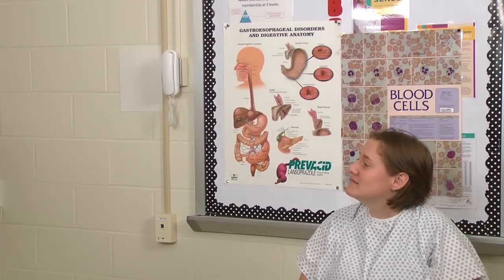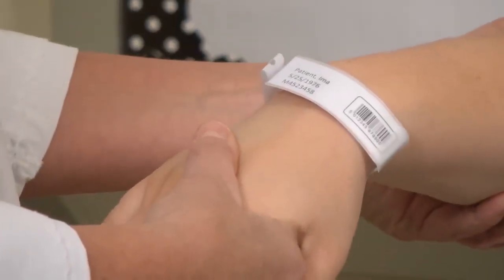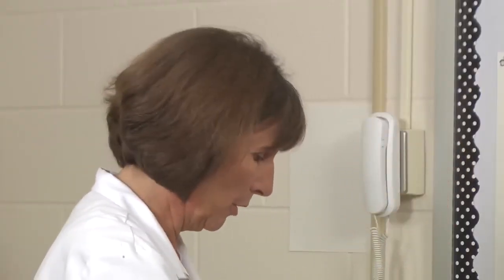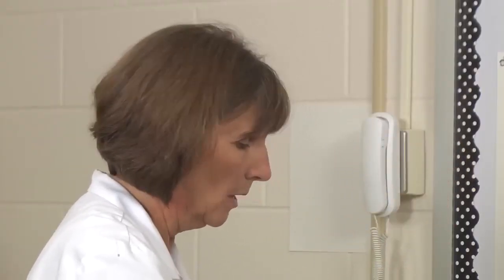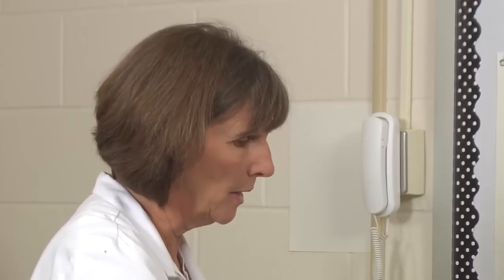Come in. Hi, Mrs. Patient. I'm Tracy. I'm going to be your nurse today. Can I check your ID band? Sure. And can you tell me your name and date of birth? I'm a patient, 52576. Great. The doctor's ordered an IV on you. So are you right-handed or left-handed? Right-handed. Okay, I'm going to look in your left hand. Usually I like to put an IV in the non-dominant hand. That way it's a little bit easier when you're eating or drinking.